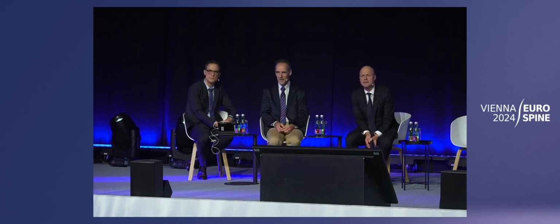And in the research study we did, it was actually CT abdomens that were done in or around the same time. But they did significantly contribute towards a further discrimination of a not so bad disc in somebody who's a little bit older versus somebody who has significant advanced disc degeneration.